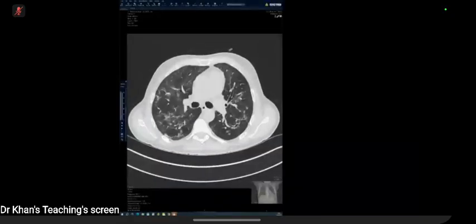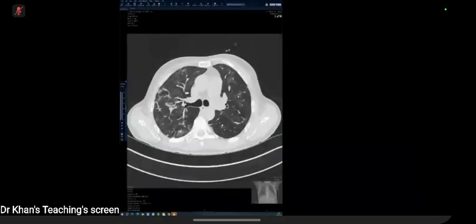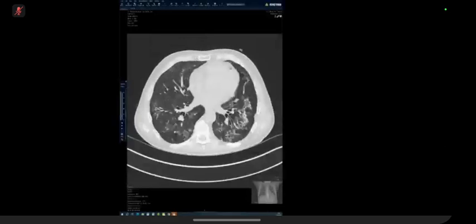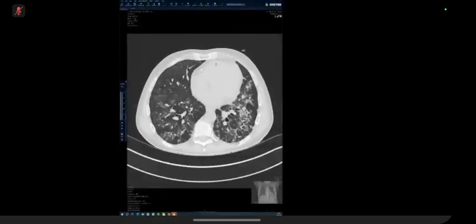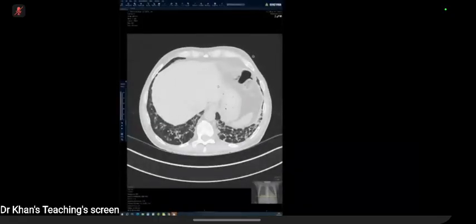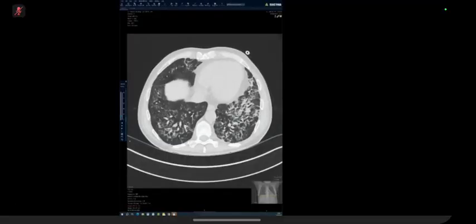When it's an interstitial looking process, you want to ask me more exotic questions like, is there a history of travel, is there a history of pets, is there a history of drugs, new drugs? And I would say yes, the patient started nitrofurantoin 3 weeks ago, and 2 weeks ago their cough started. So this is actually a nitrofurantoin lung, and this is starting to fibrose. It's drug-induced interstitial pneumonia. Drug-induced, exactly. That's the diagnosis here. Okay, so I think we're running over.